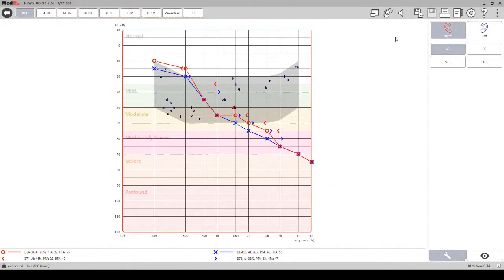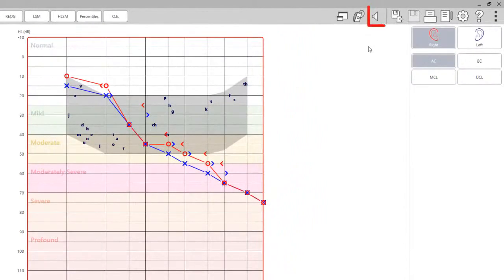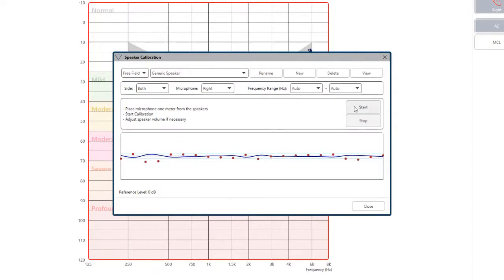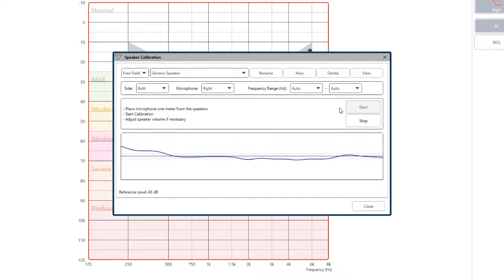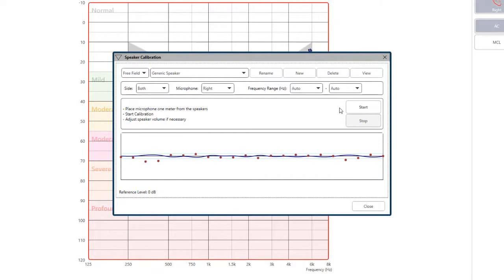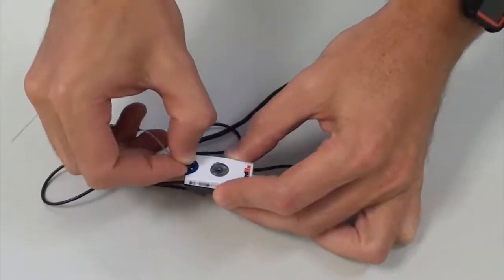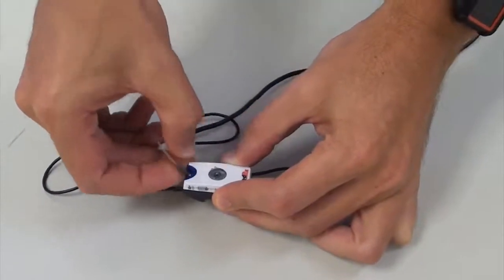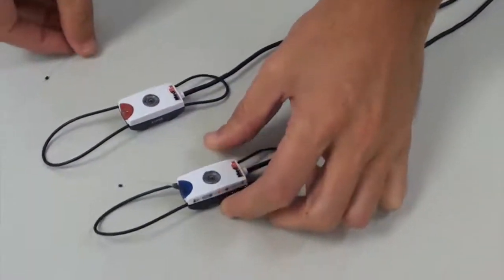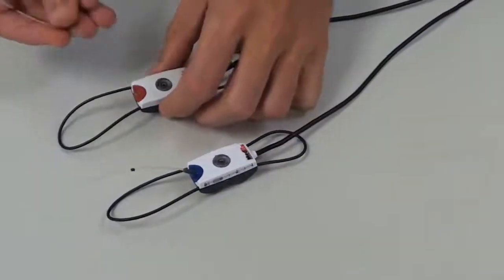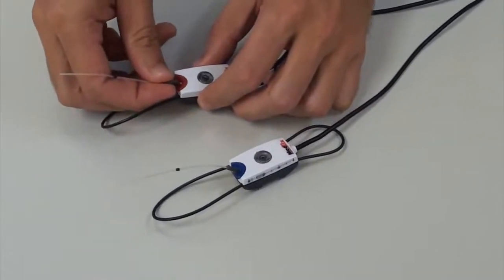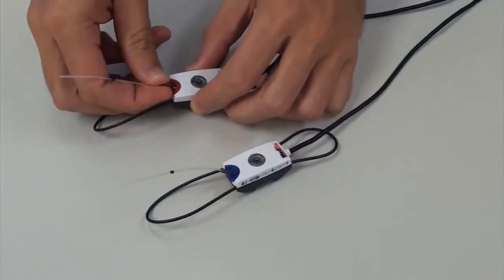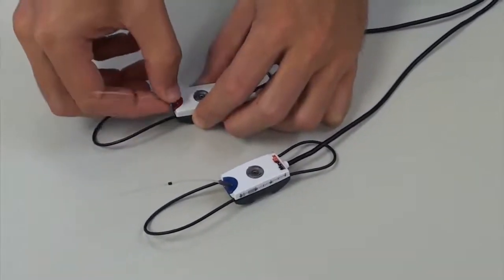To calibrate the speakers, click on the speaker icon at the top of the screen. When you click start, you will hear the calibration noise. Make sure to attach the probe tubes to the reference microphones and place them about one meter from the speakers. It is important to not have anything blocking the speakers.